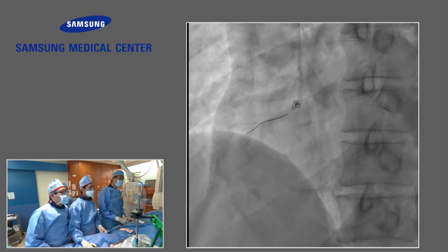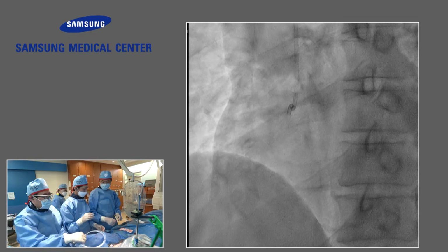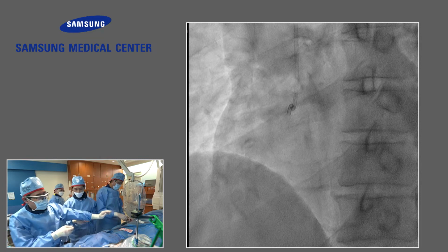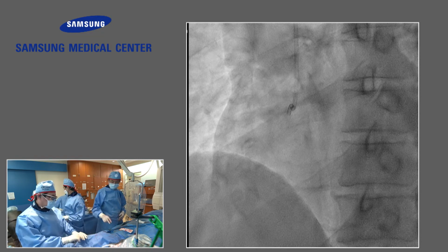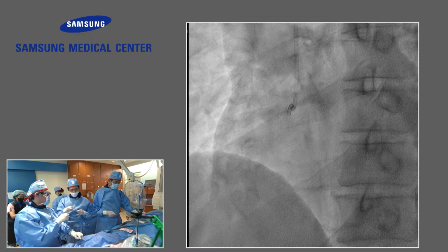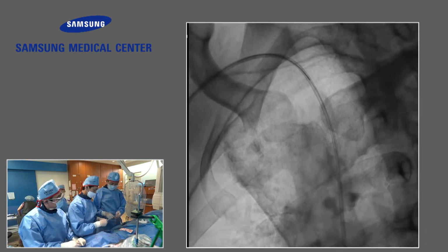his probing was really wonderful, and the run through wire crossed. Give me a new wire. The first wire's curve is too large, a new one, because I was in a hurry. So, a new run through.